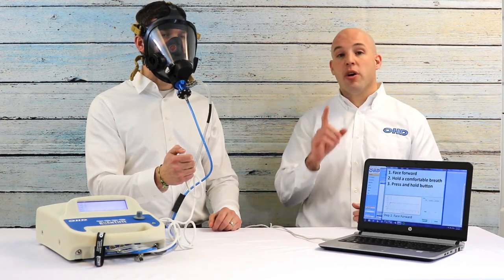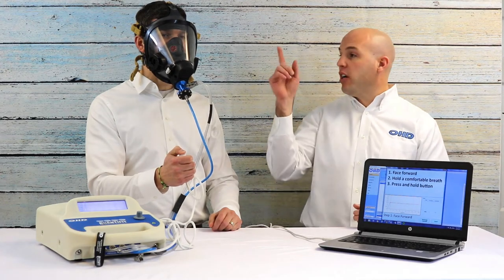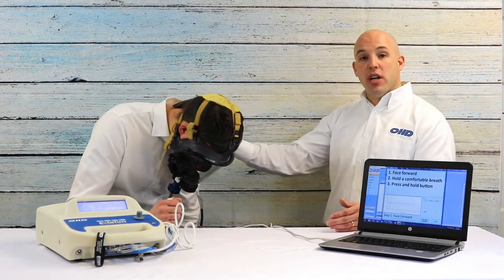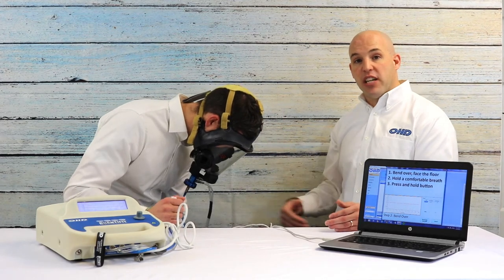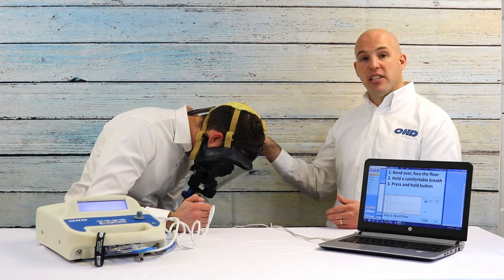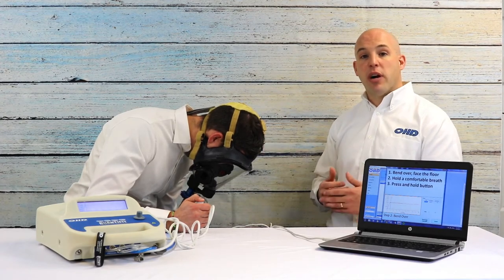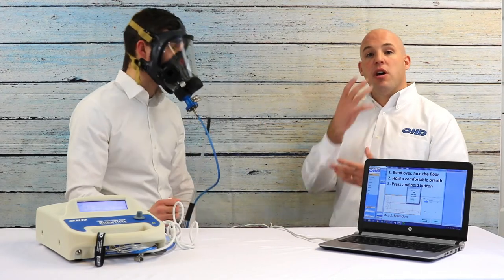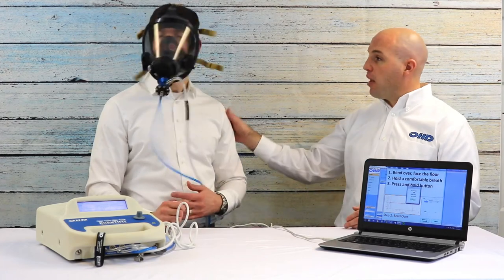He takes a breath in, holds his breath, faces forward, and remains completely still. The Quantifit is pulling a pressure on the respirator and looking to identify leakage — he gets a pass on that step. He can take as much time as he wants between steps. Step number two is face the floor — he faces the floor, presses and holds the button, remains completely still, and holds his breath. This is the gravitational step, testing whether the gravitational pull on the respirator creates leakage.